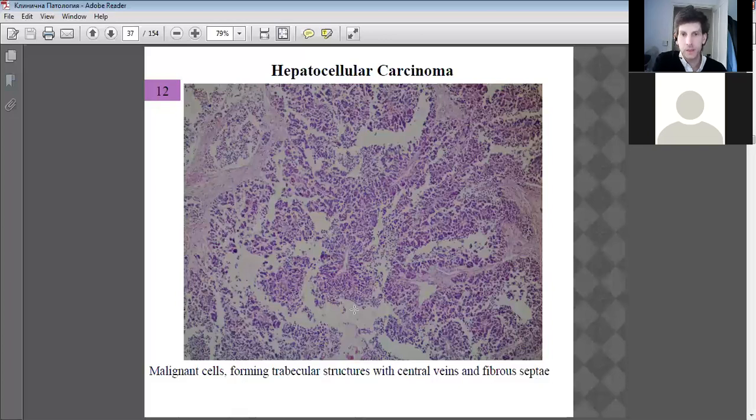Good. So here we got right there, if he asks you where's the central vein, this one is a central vein, yeah? But all the tissue around our central vein has started to degenerate, to form lots of spaces here. Lots of spaces. And this is due to the abnormal cell division as a consequence of the tumor. And this whole area is the tumor, tumorous tissue. Okay?